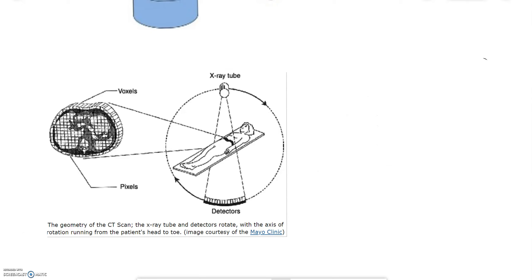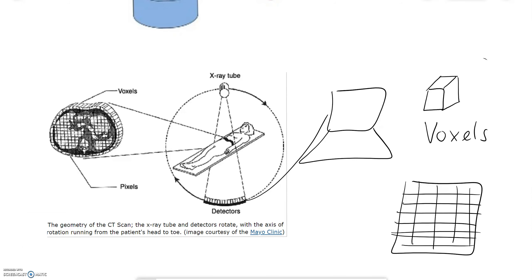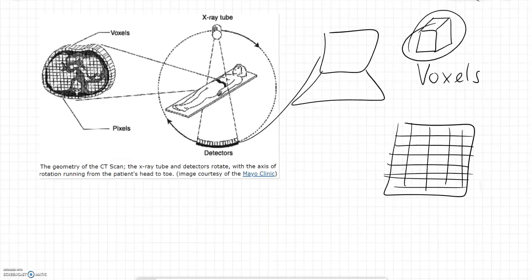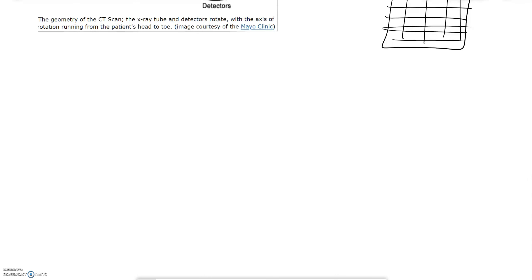What the computer does is it breaks the body up into little three-dimensional cubes. These cubes are called voxels. Imagine them a bit like pixels. Pixels are the equivalent, but in two dimensions. Your screen now you're looking at is broken up to millions and millions of tiny little pixels, which come together to give you the whole image. But because your human body is three-dimensional, unless you're Homer Simpson, your body's split up into these tiny little voxels. Now, how do these work? Well, I'm going to show you that down here.